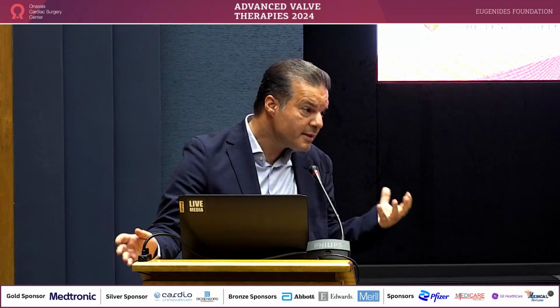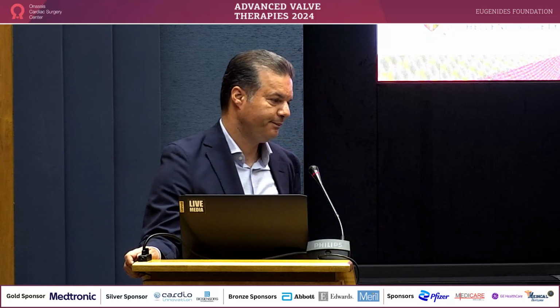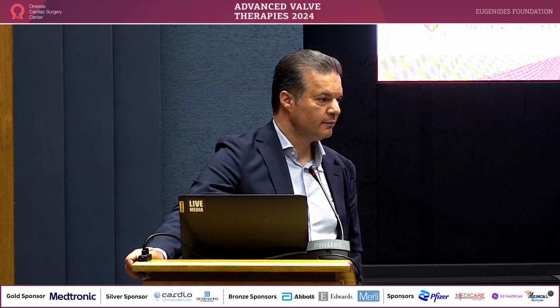So maybe there's a concept there. I mean, it's very early to say. It's just one case. May I remind the people that were here last year that Nikitopoulos presented last year in this conference the Batman technique, so he has an excellent result. Yeah, exactly, yes. So that was good.